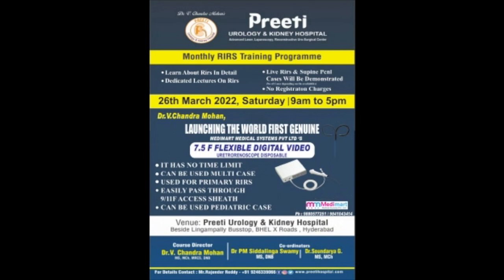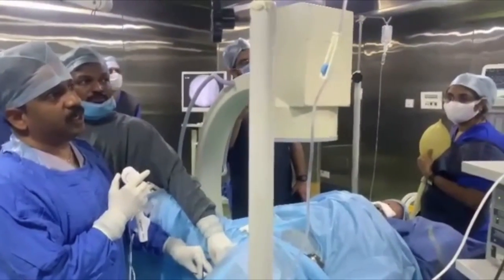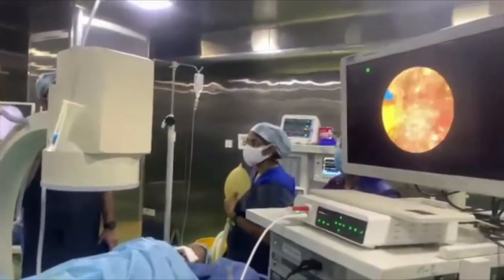Here is a case where we have used a flexible ureteroscope — a disposable scope from a company called Hugmed. It is a very small scope, 7.5 French, which goes through a 9 by 11.5 access sheath.